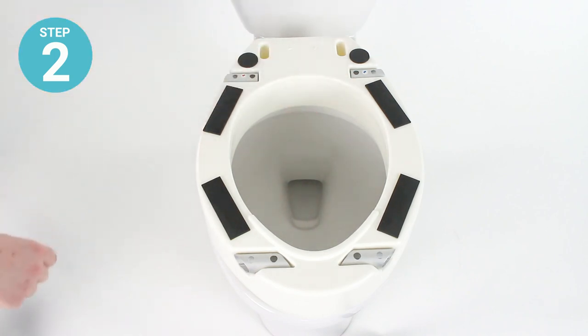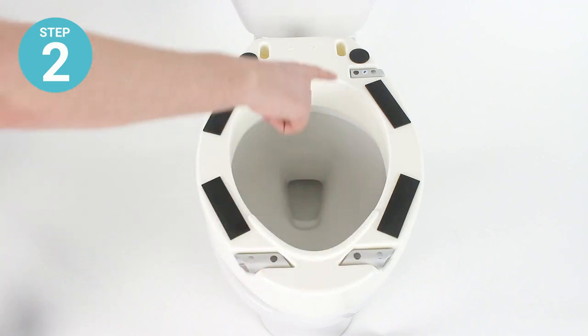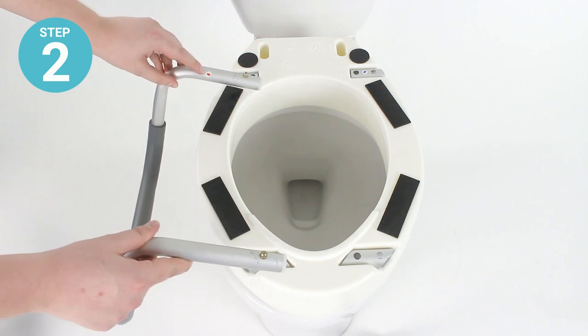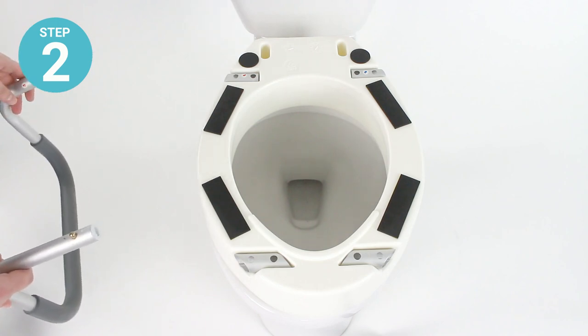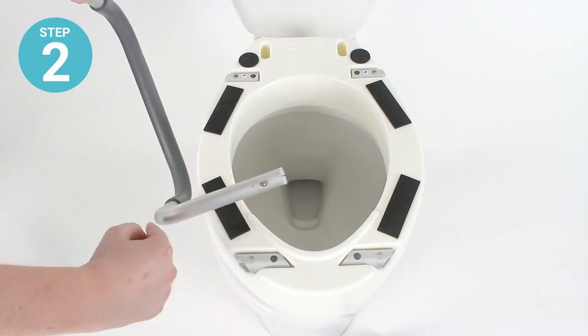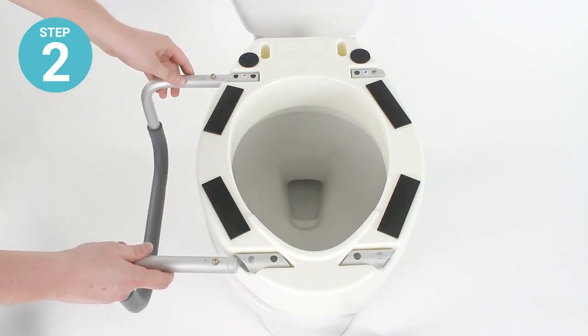The sockets will be labeled with red and blue arrows. The red arrows will correspond to the user's left side and the blue arrows to the user's right side. The armrests will also show corresponding stickers to indicate which set of sockets each armrest should be fitted into.